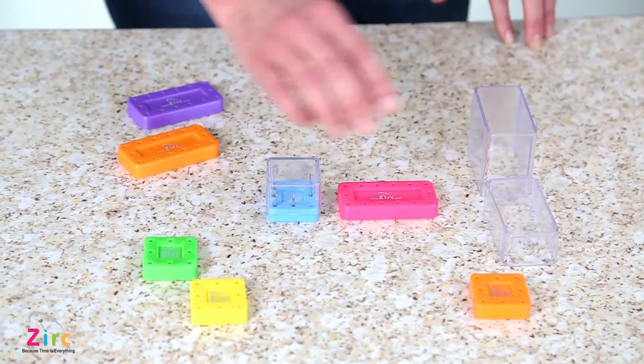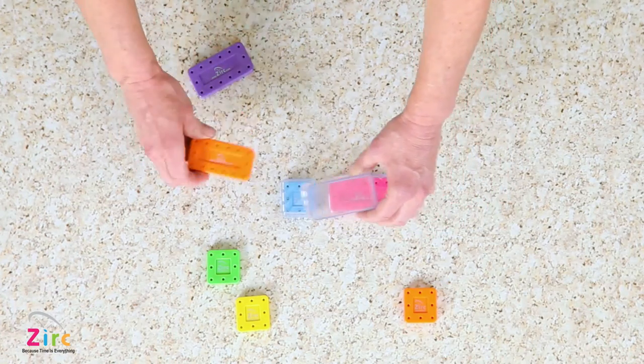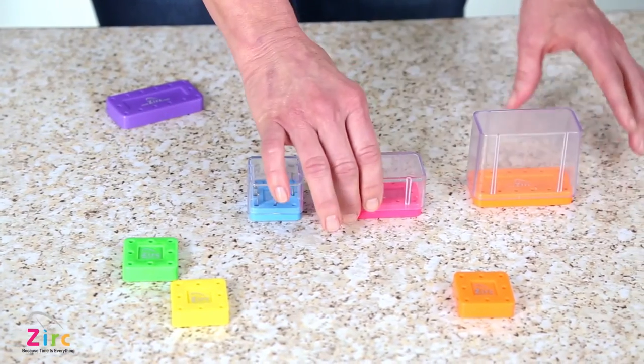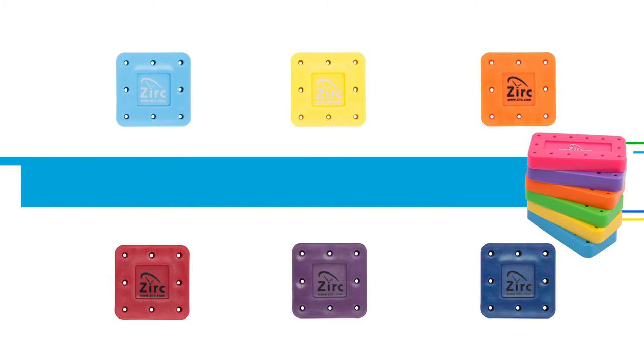Both sized blocks come with covers to protect the burrs during storage, with taller options for longer burrs. To learn more about Zerk's burr products, please visit Zerk.com.